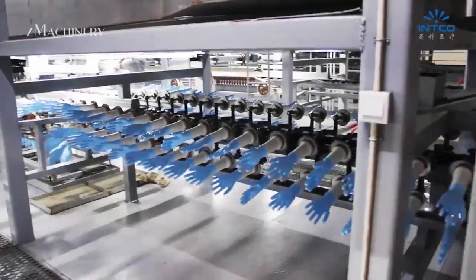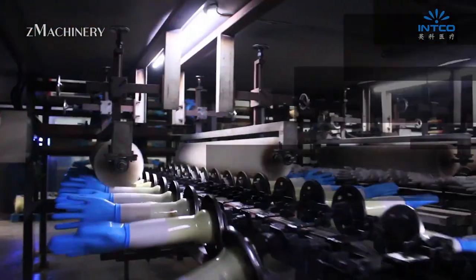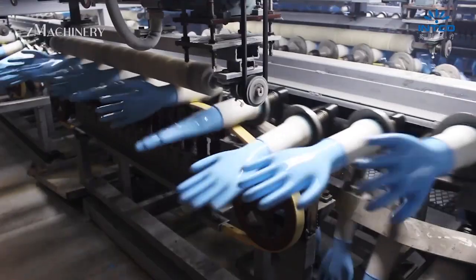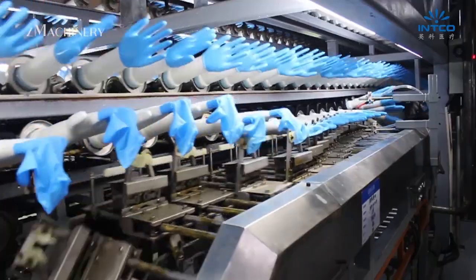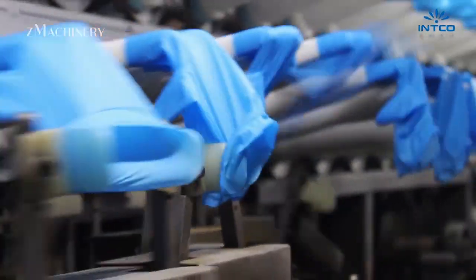Ceramic hand-shaped formers are cleaned, dried, and then coated with a coagulant that helps the glove material adhere. The formers are dipped into the latex or nitrile solution, forming a thin, even layer that becomes the glove. The beading process follows, where glove cuffs are rolled to improve fit and ease of use. The formers then pass through multiple ovens in a vulcanization stage.